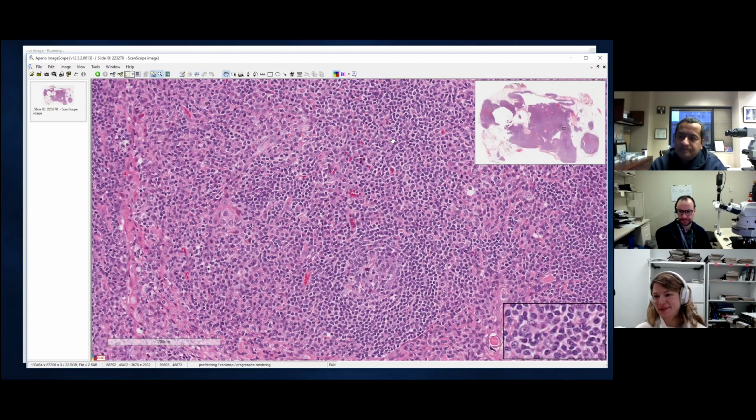Because you can see various small lymphoid expansions in the paracortex as well, or even an angioimmunoblastic lymphoma, which is a T cell lymphoma. At the early stages in particular, you see this paracortical expansion of monocytoid cells, as well as variable germinal centers and plasma cells. It can be dangerous. It could potentially mimic a marginal zone, and you definitely would not want to mix those two up, completely different things going on. So I just want to make double sure what you've got. Let me see if I can show you the CD3 versus CD20 on this particular case.